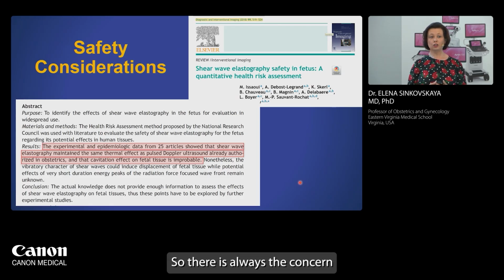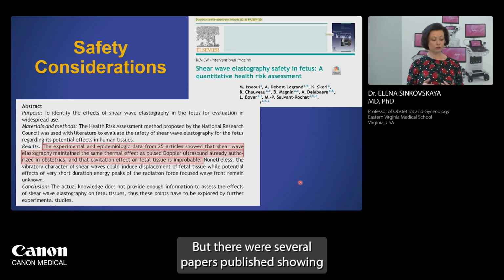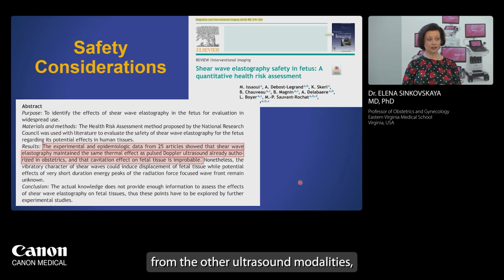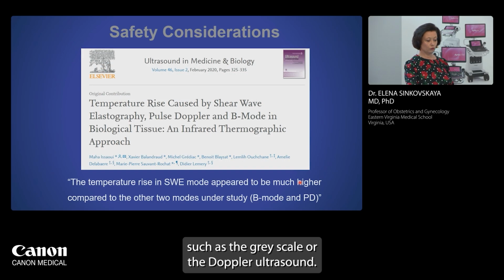So there is always the concern for safety, particularly when it's used in pregnancy, but there were several papers published showing that indeed the impact and the potential artifacts are not different from the other ultrasound modalities, such as the grayscale or the Doppler ultrasound.